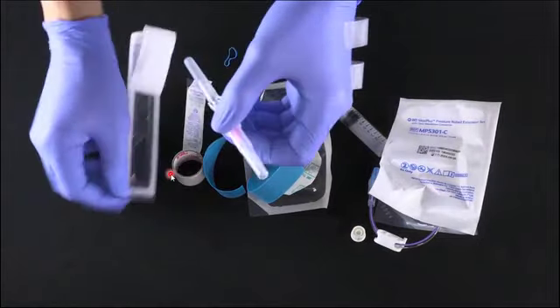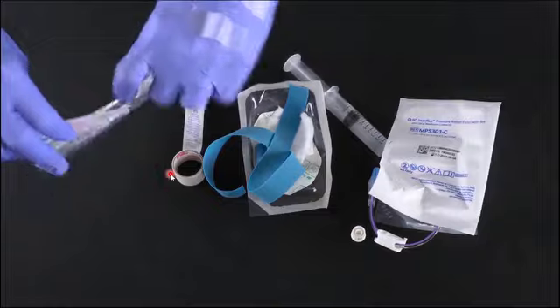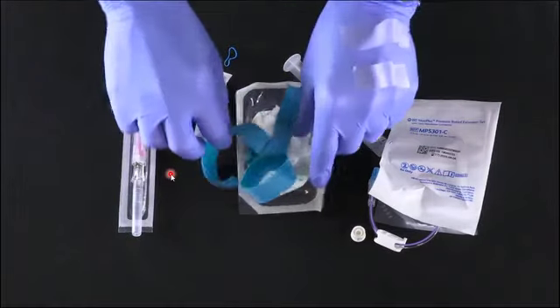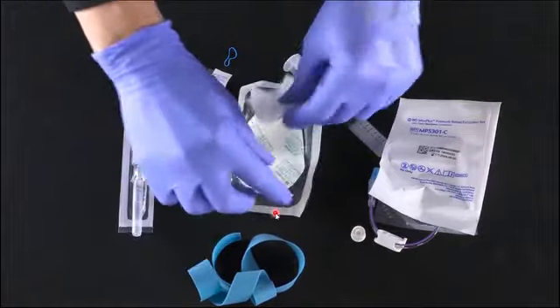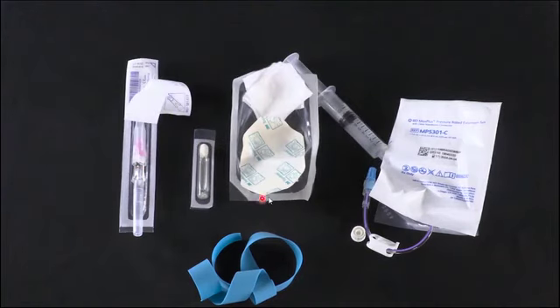Then you want to open up that IV. That's your next step. What I like to do is pop this cap off, because the last thing you want to do is have the tourniquet on, everything's prepped, and you can't get the cap off and you look kind of silly. And also, it's very frustrating for you, and it kind of doesn't get you out of that mindset. Once that's all set, just make sure that that's put back in. But once it's all set up, then set it up the way that you feel most comfortable, that way you can grab it in sequence. For me, I like to have everything laid out like this, but it is also personal preference.